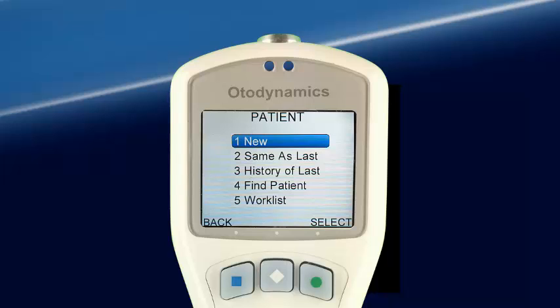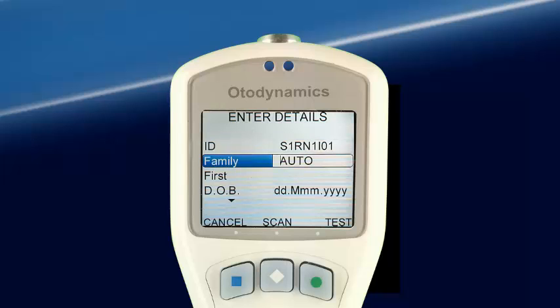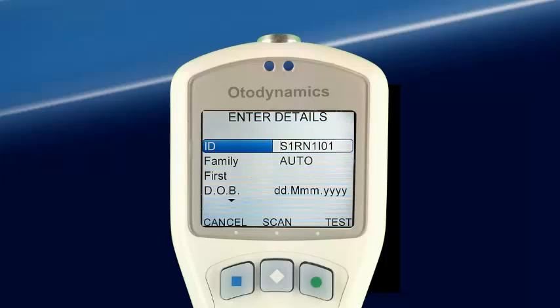Worklist is a very powerful tool for downloading patient demographic data from a computer. Selecting a new patient brings up the Enter Details screen. The Otoport automatically provides a unique ID and Auto as the family name if patient data has not been provided. Patient data can also be scanned from this screen using the optional scanning features of the Otoport.